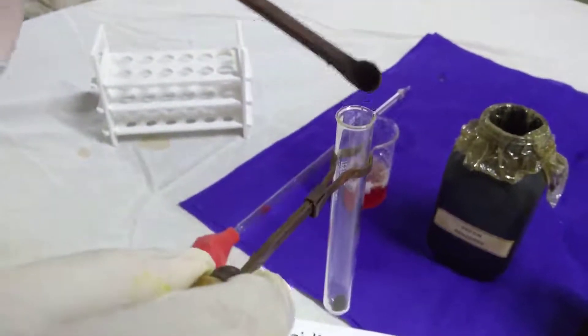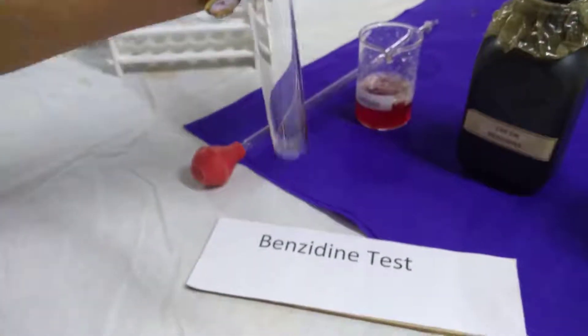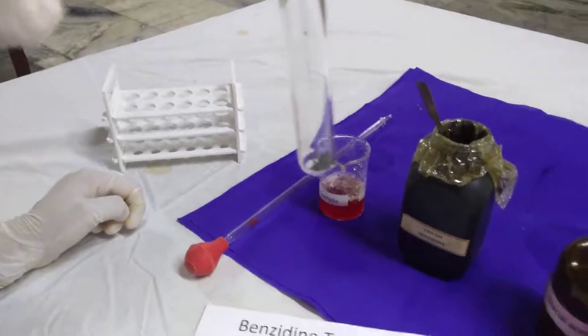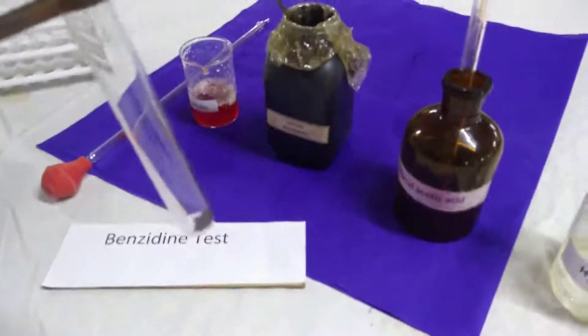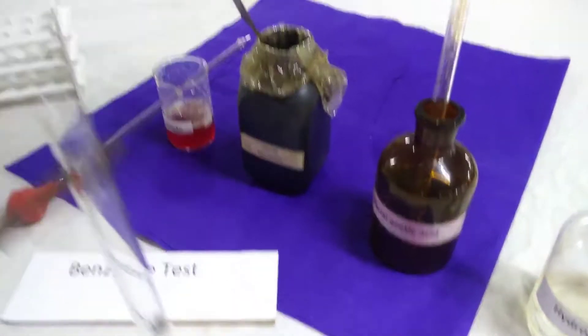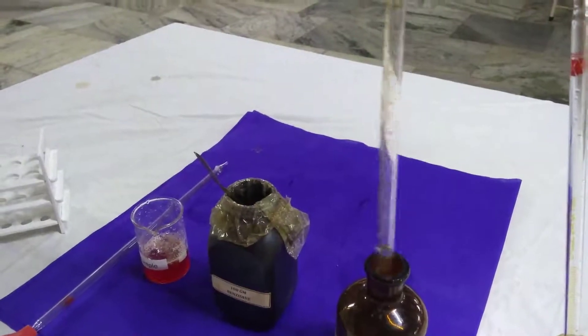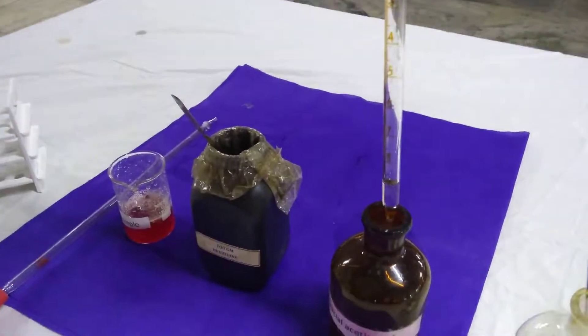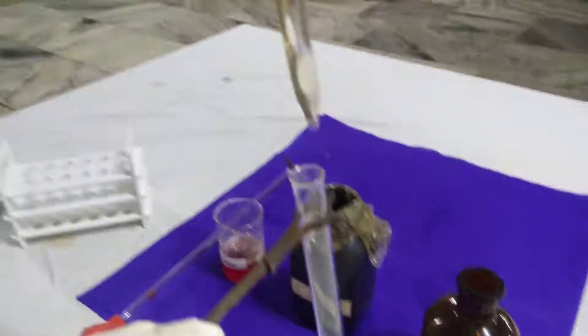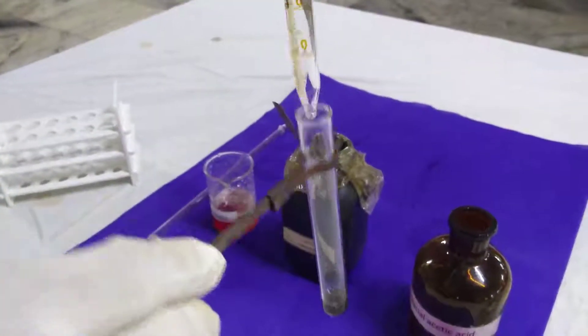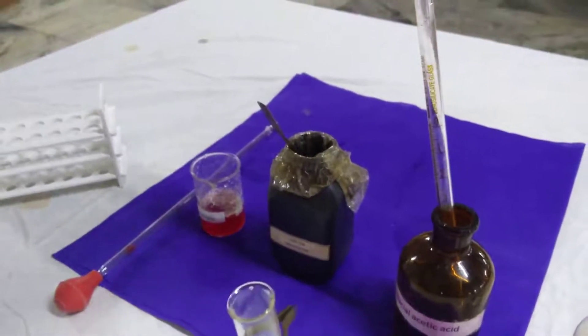To this, add 1 ml of glacial acetic acid. Then add 1 ml of hydrogen peroxide to the test tube.